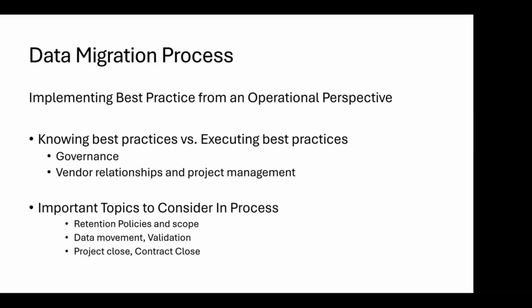In my career, I've done a lot of migrations. Some of the early ones, I would definitely go back and do things a little bit differently. One of the most important things to highlight is governance. It's part of the strategy, and governance for stuff like migrations is super helpful. I often find that migrations are tied to some other large project, whether that's a hardware refresh, a software platform refresh, implementing a new PACS, or changing PACS vendors. There's usually a data migration component that drives that larger project. And I think from a governance perspective, you'll see some overlap.